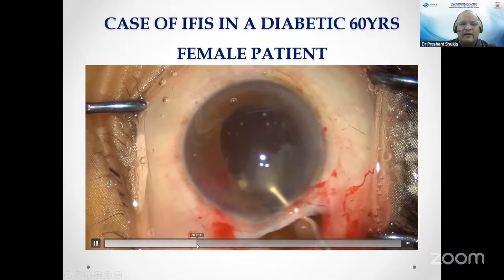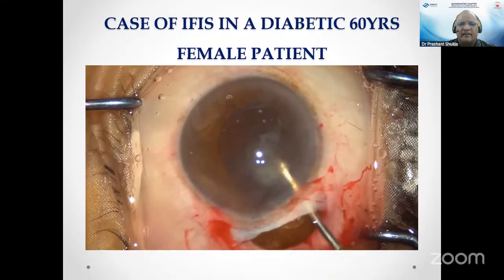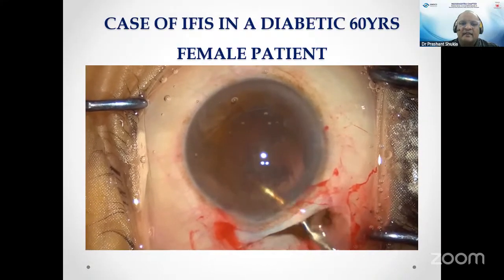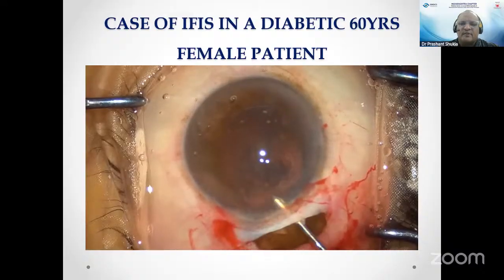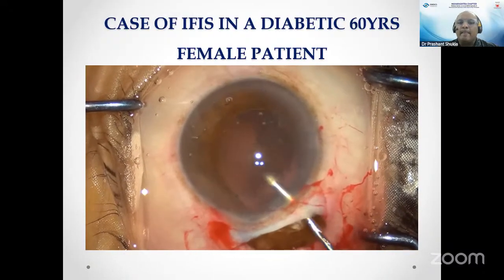Here the bimanual irrigation system comes. The iris was coming out again and again, so I thought let's just leave it for a while and remove whatever cortical matter as well as the cortex which is sticking on the posterior capsule. Just remove it using the irrigation handpiece first.